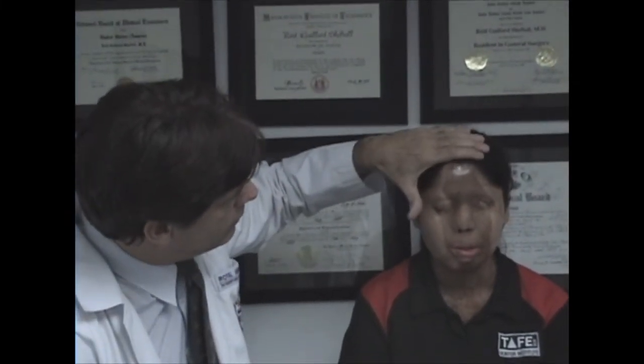And then in about 2 months, we're going to remove the expanders and remove the burned tissue here where the hair follicles were damaged so the hair didn't grow back. We're going to remove all this tissue, take the extra skin that we created with the expander, and bring it over to create a new hairline for Sreya, something in about this area here.